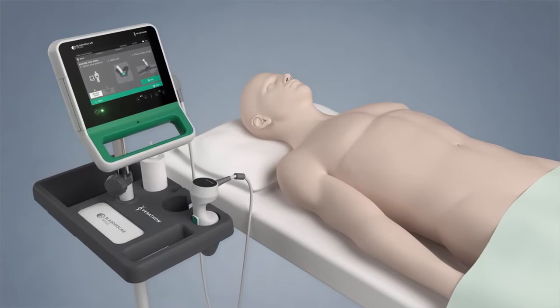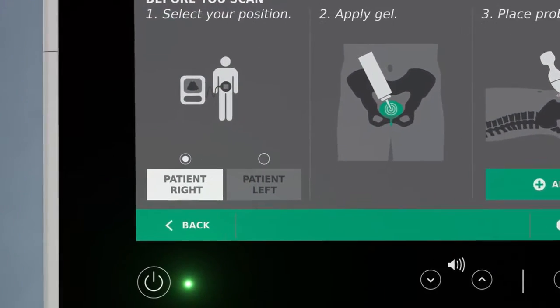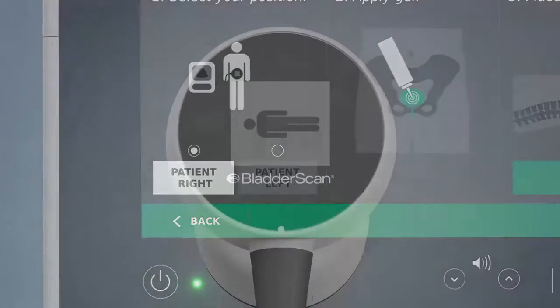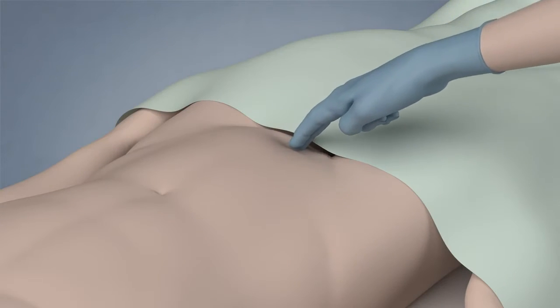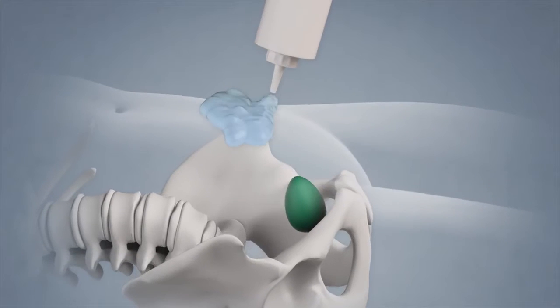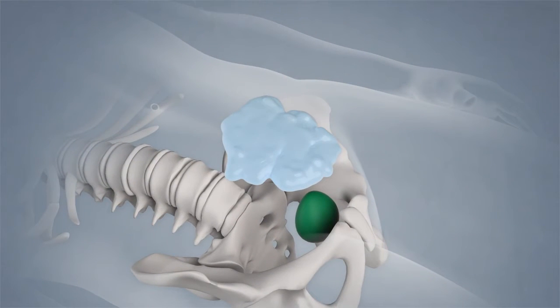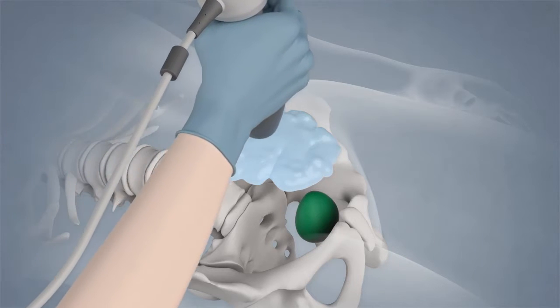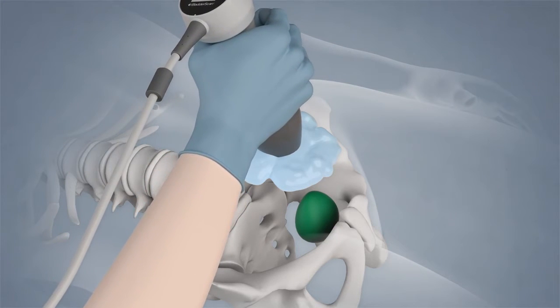Have the patient lie in the supine position. Select the patient orientation — the default is to scan from the patient's right side. Palpate the patient's pubic bone. Apply a generous quantity of gel midline approximately three centimeters above the pubic bone. Place the probe on the gel and aim toward the expected location of the bladder. Rock the probe gently to seat it against the abdomen.